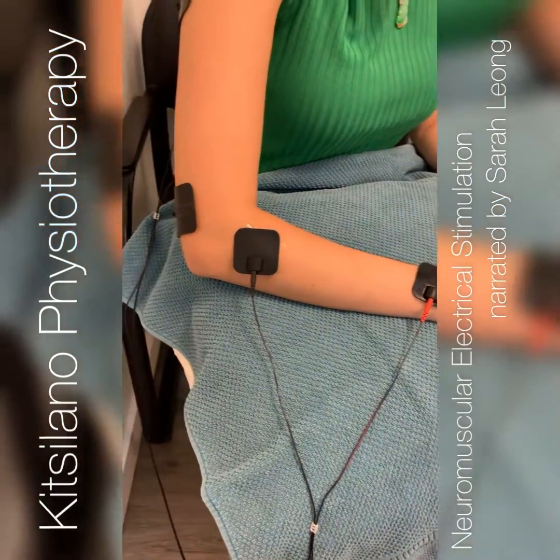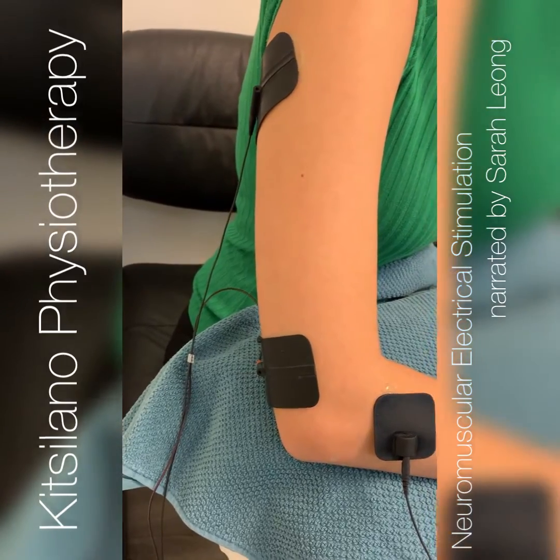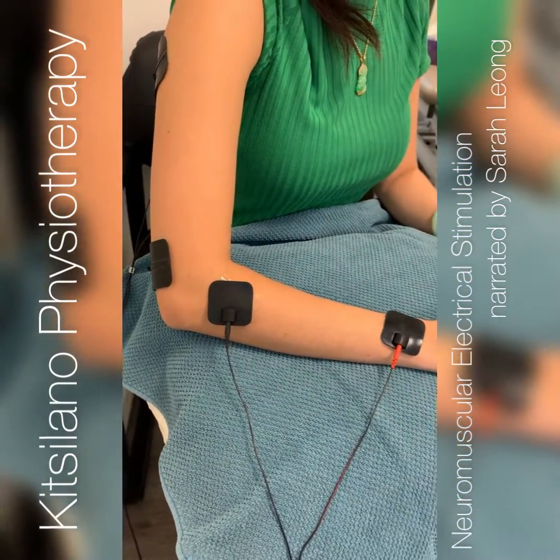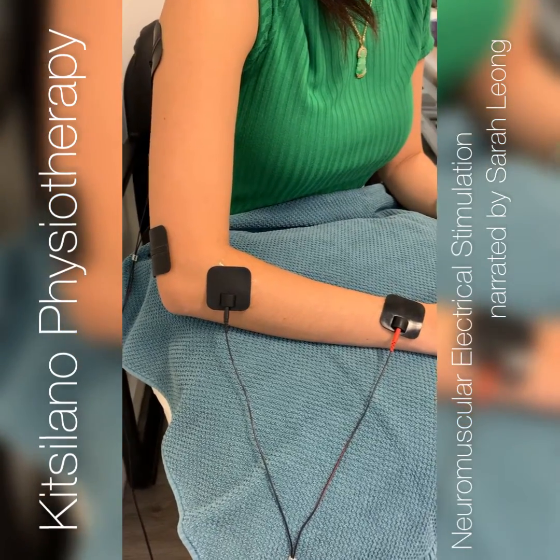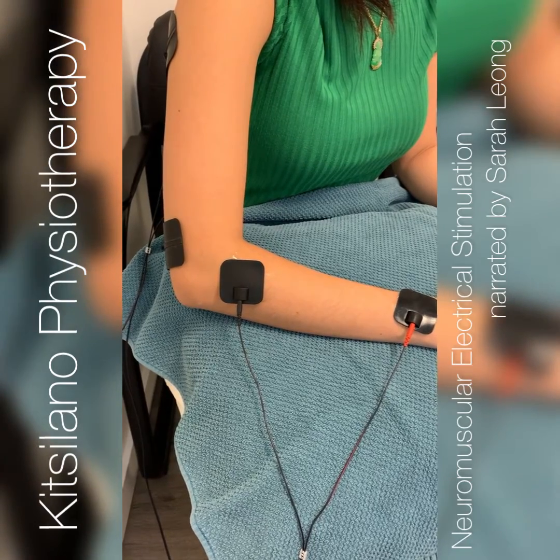What I'm showing you today is NMES, which is a muscle strengthening and stimulation technique that we can use in physiotherapy for weak muscles or muscles that are set in a certain position due to neurological muscle tone. We do often use it for strengthening here though.